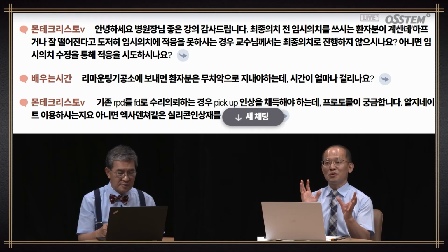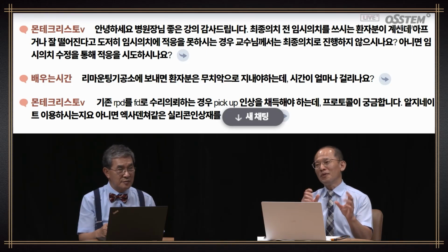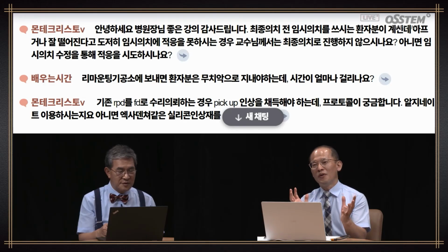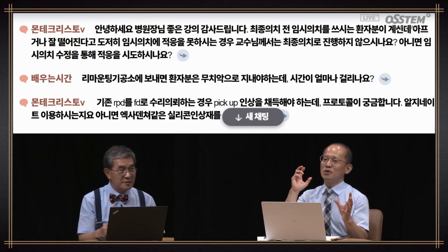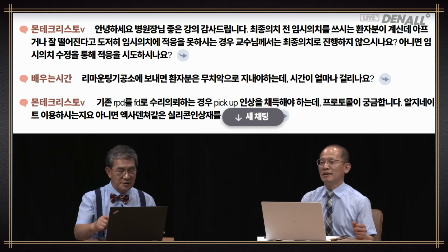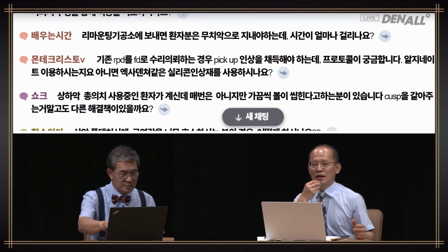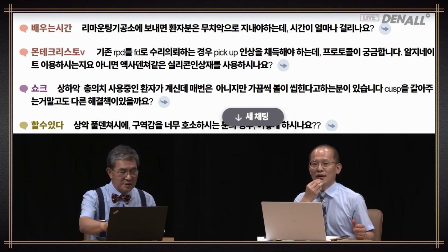The form, shape and borders all need to be adequate, even if it's temporary. If the patient still cannot adjust to it, then in the final prosthesis, of course occlusion would remain, but you have to adjust even the temporary first before moving to the next step.